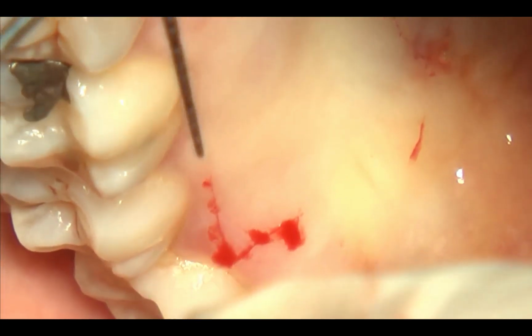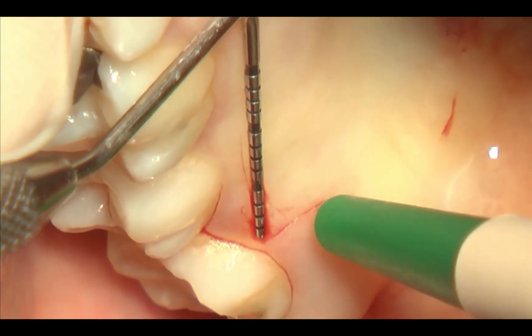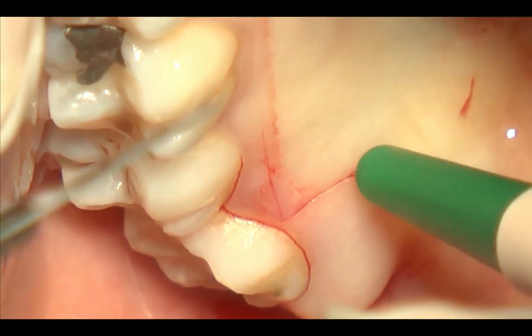After designing the distal vertical releasing incision, we checked for the measure. We said it should be 8 millimeters, and so we can make the second vertical releasing incision.